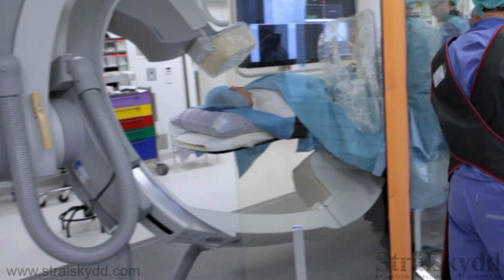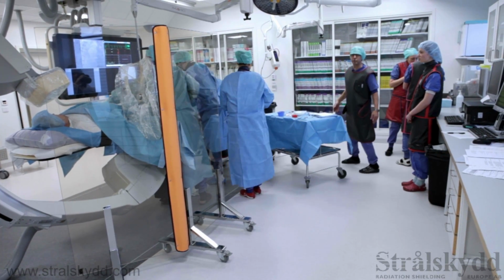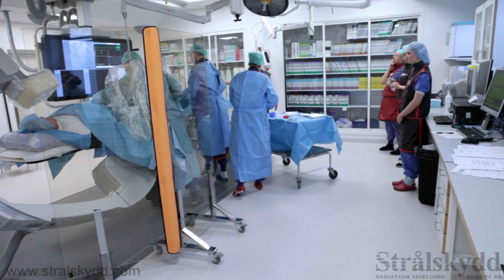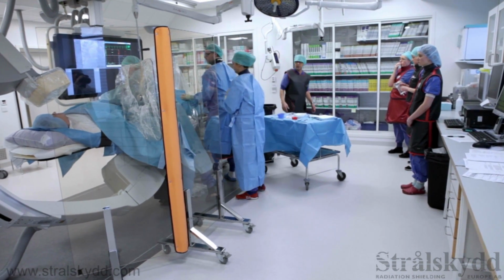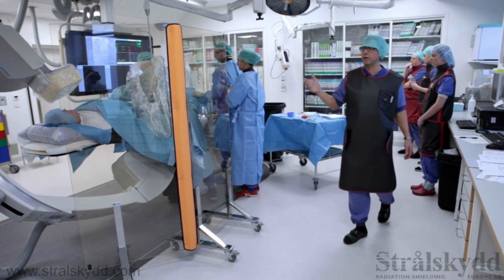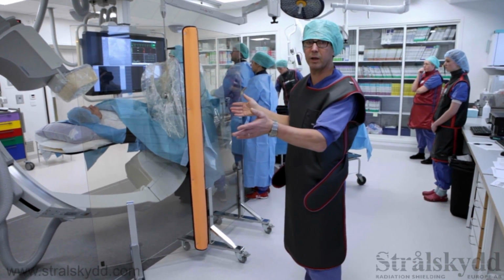And I can walk all the way through the room. All of my staff are protected, and not until I get over here at the left side of the table would you have radiation. And that is approximately 40% of the room is protected with this simple way.